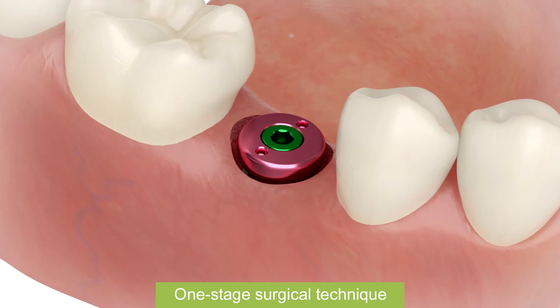Healing abutment is in place. Sew up and leave for 3-6 months.